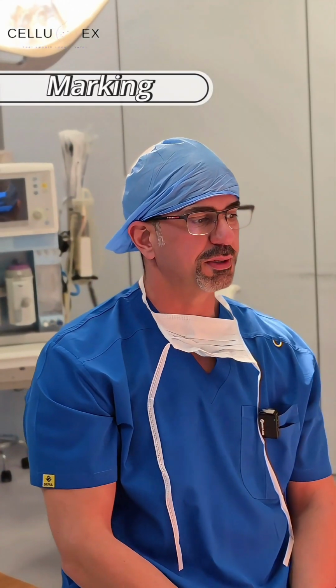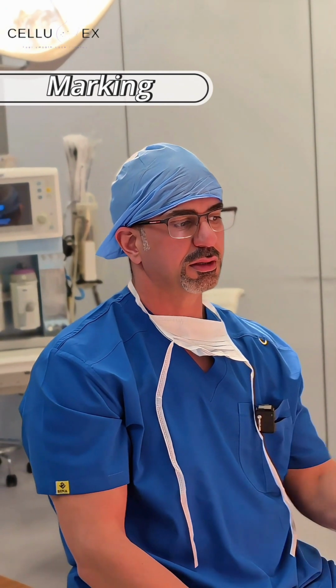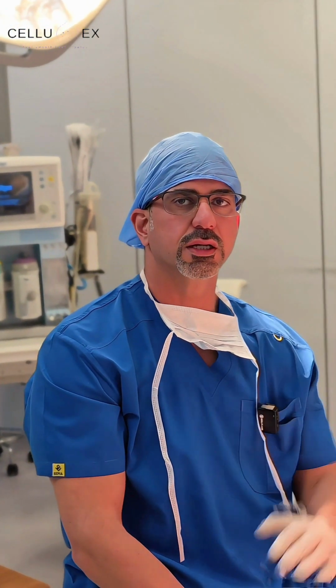How to position the patient. Positioning the patient, the marking should be done while the patient is standing, because when they lay down, the cellulite will disappear and you cannot see it. So the patient would stand.